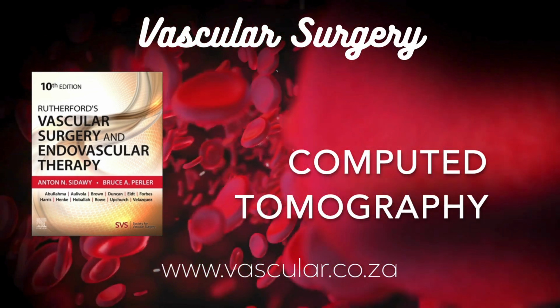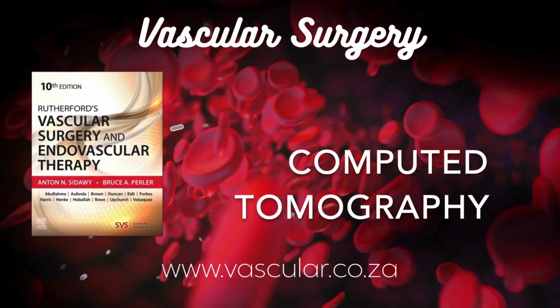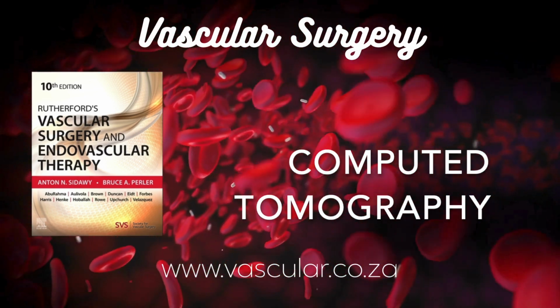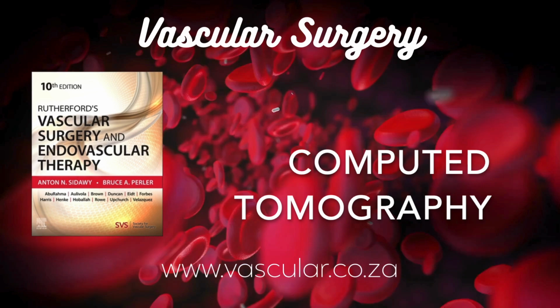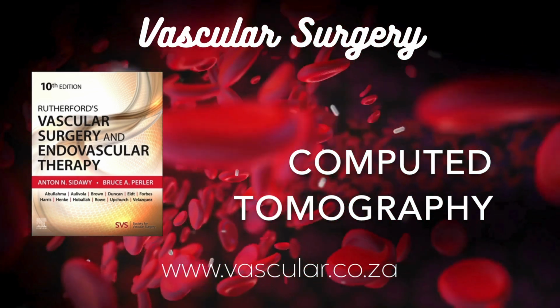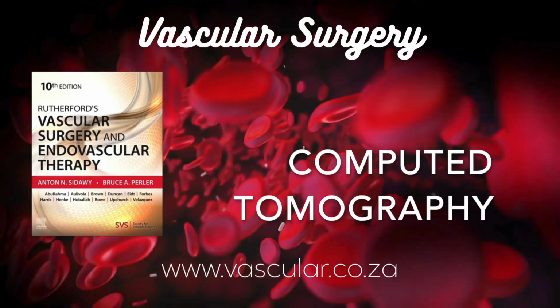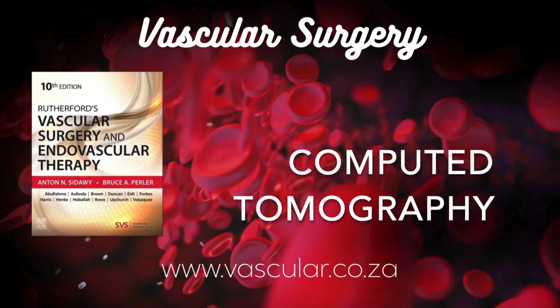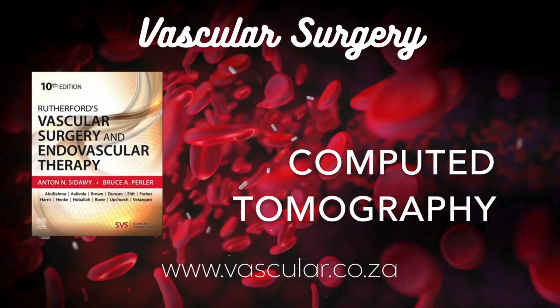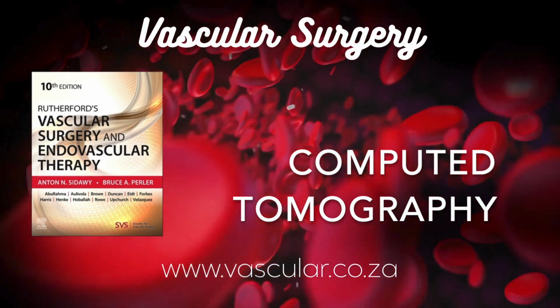It did, and in many ways, it delivered, iterative reconstruction, for example. But paradoxically, the demand for ever higher image quality, thinner slices, and advanced post-processing often pushed clinicians to use techniques that inherently required more radiation initially, relying on the tech to make up for it. Plus, CT is now used for screening colon cancer, lung cancer, coronary calcium. Right, more scans being done on healthy people.